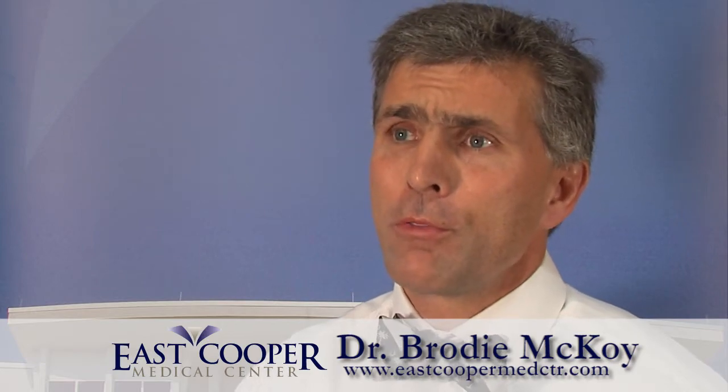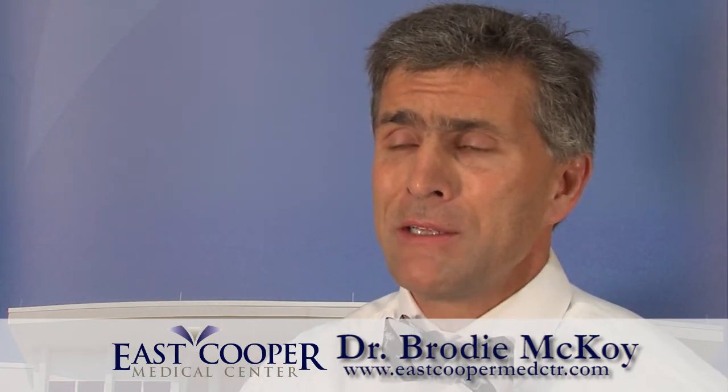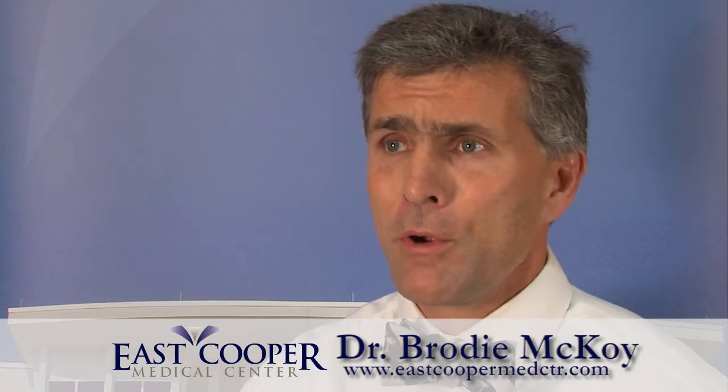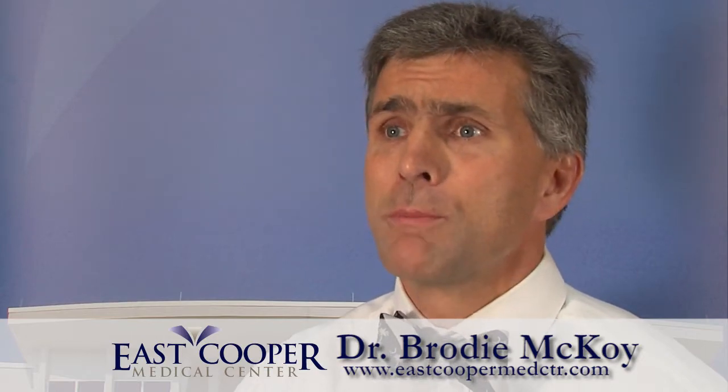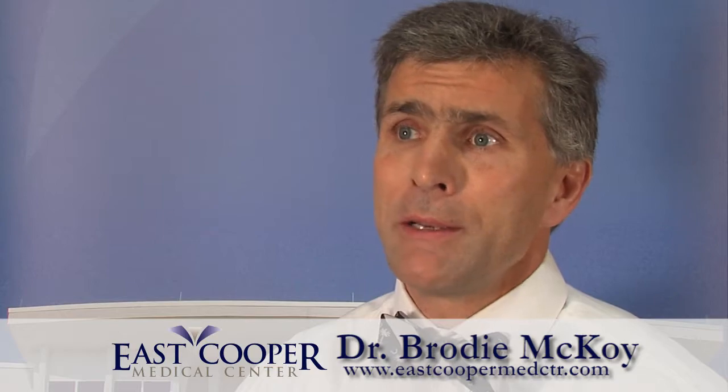Partial knee replacements have been technically difficult throughout the years because of implant placement as well as ligamentous balancing. It's much more difficult to perform than total knee arthroplasty. With the new technology called Makoplasty, we're able to precisely and reproducibly place an implant in a patient's knee.